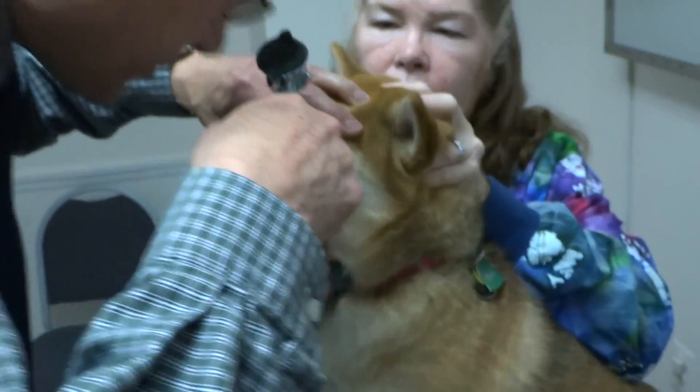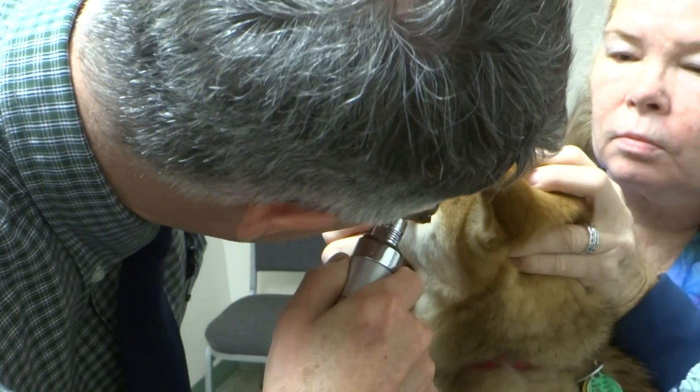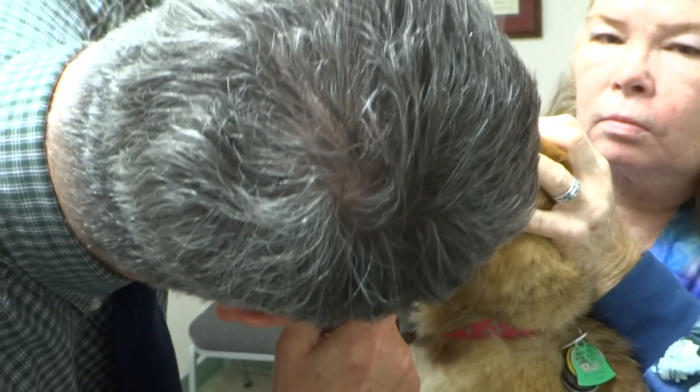Okay, you can make it a little light. I don't tell you, you've got a really nice looking angle here — wide open, nice ligaments. Looks really good. I'm going to turn the light back on. I'll just do it like this so you can see what I'm doing with the light on it. Essentially, this is allowing me to look right at the angle, which looks beautiful.